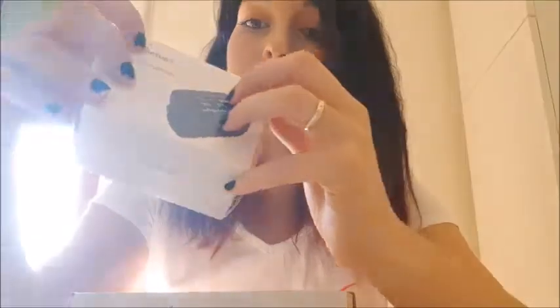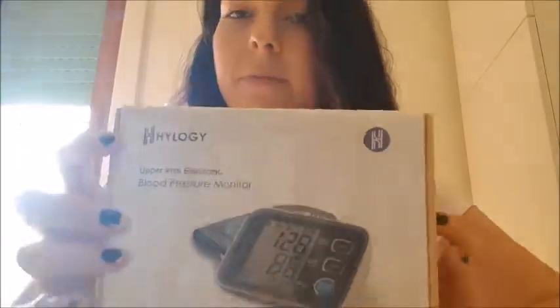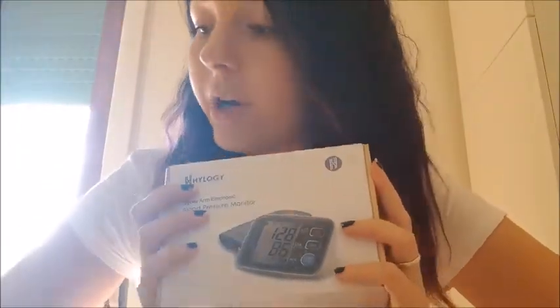Today I'm going to be opening these two packages. This is the brand — I don't know it, it was just Amazon's choice — but the price was really good so I decided to get it. I think both of these items are a good idea to have around at home just in case. I also got an upper arm electric blood pressure monitor, same brand.